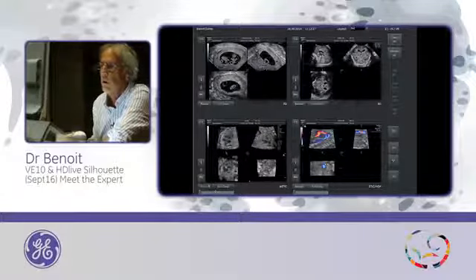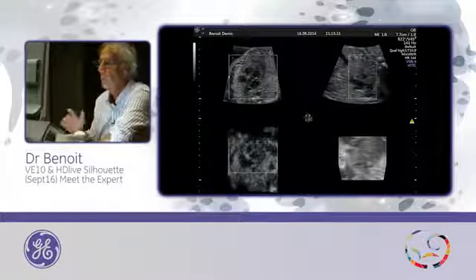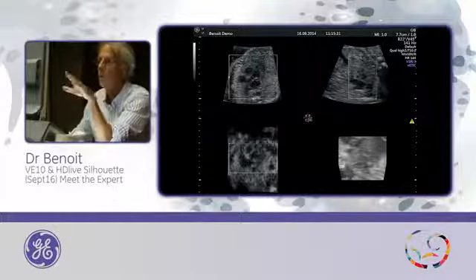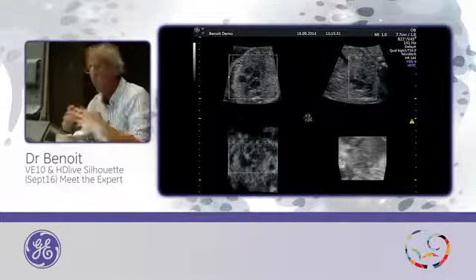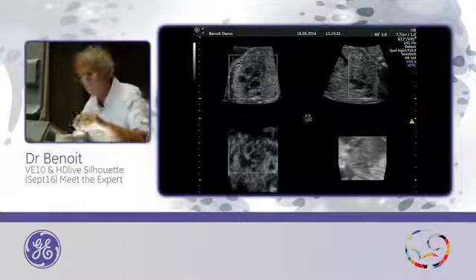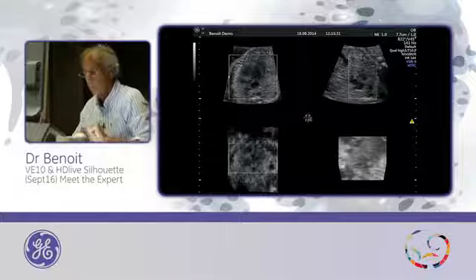Okay, so the last one, maybe you saw in my lecture a heart with the view from the back, and it was this case, and I will try to reproduce because sometimes you do some nice picture, it's difficult to do it again. So this is a STIC. I start.